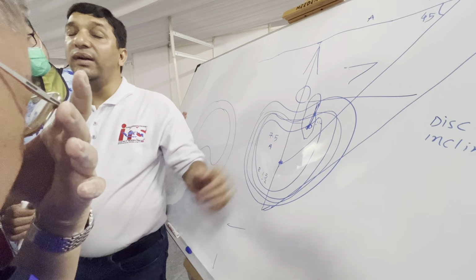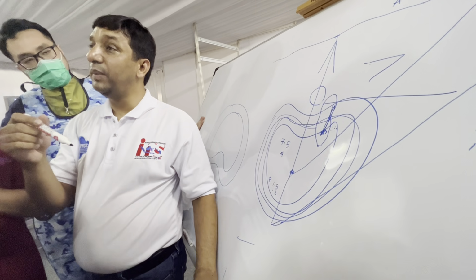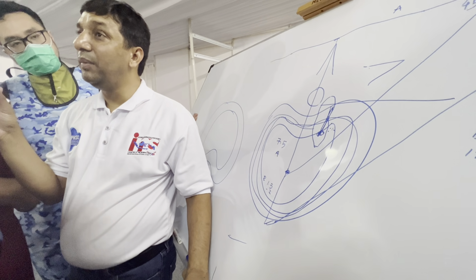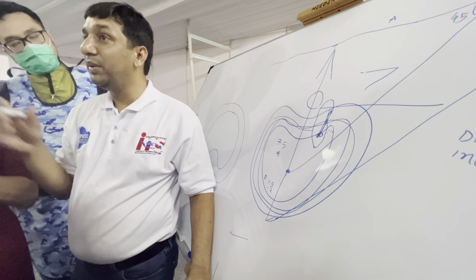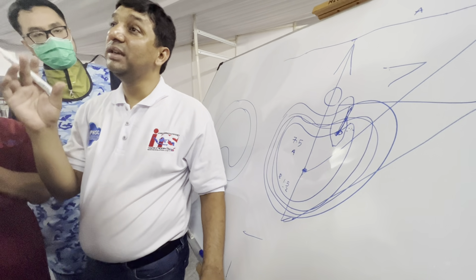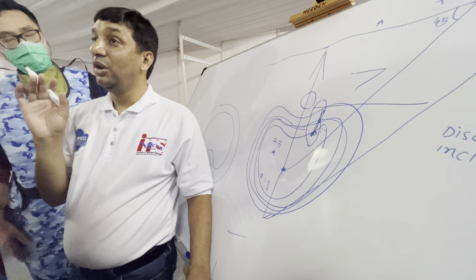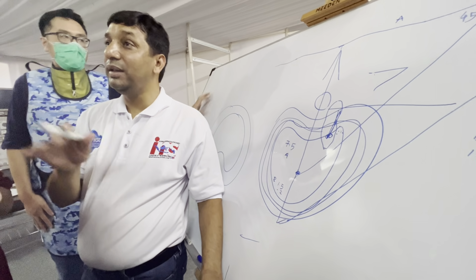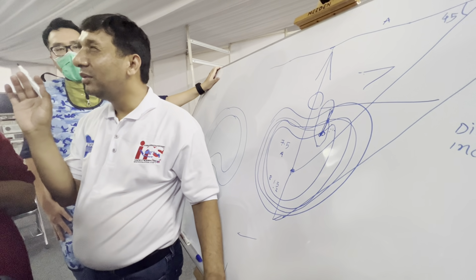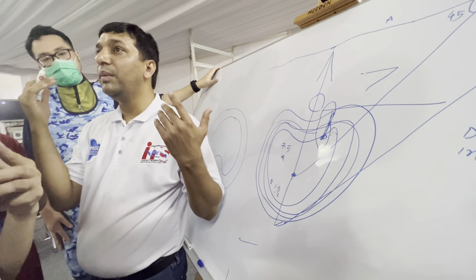This is a big advantage compared to the outside-in technique, where you directly go to the epidural space and there is a hell of bleeding, because the fragment material is there, there is a lot of inflammation, and you have the nerves. Your visualization starts only after you put the sleeve and dilator. So you may have already done the damage, and now you are saying, oh my god, what is this? This looks like dura. Or you see a gush of blood coming.